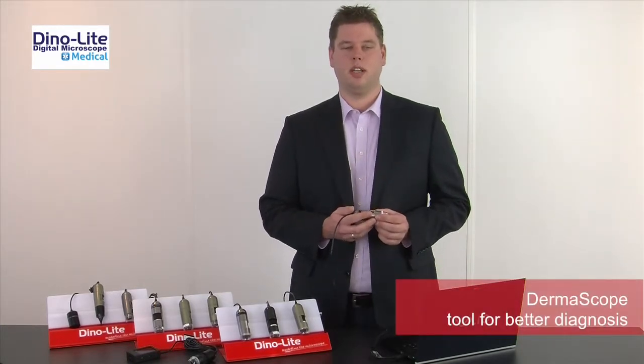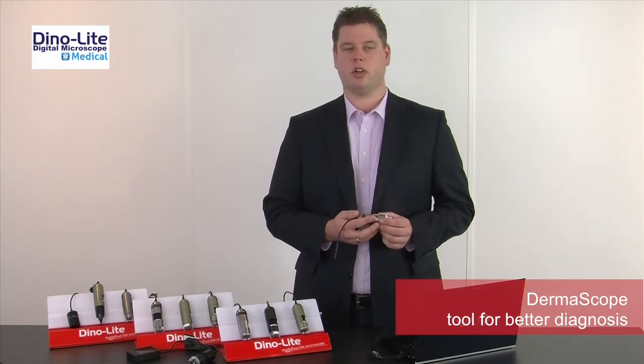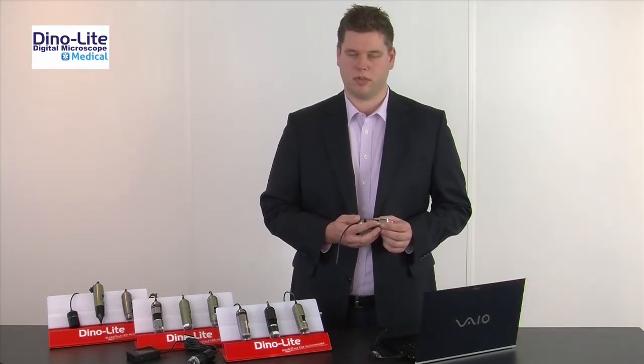The Dynolite Dermascope offers best-in-class image quality. It is an easy to use and powerful tool for dermatologists, general doctors, aesthetic medical professionals, and so on.